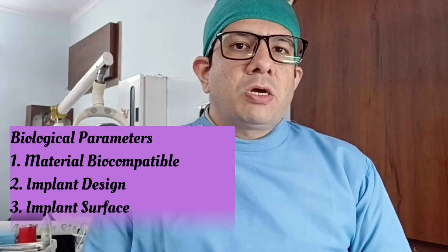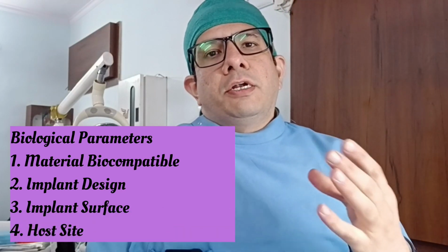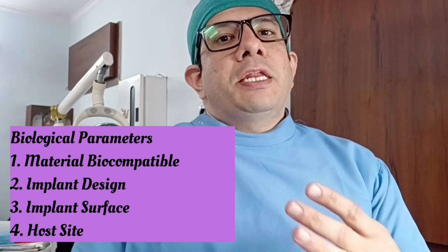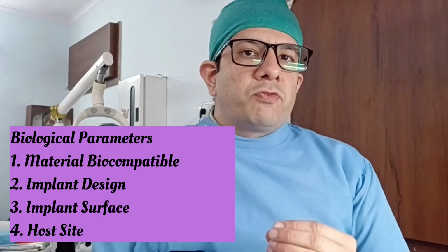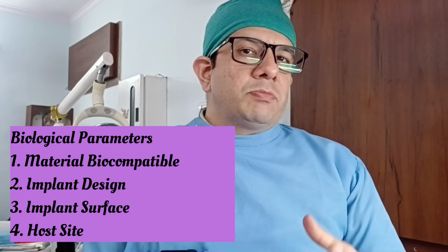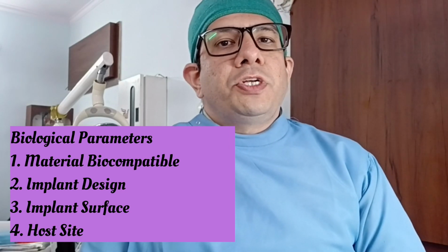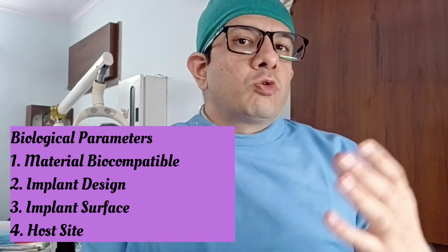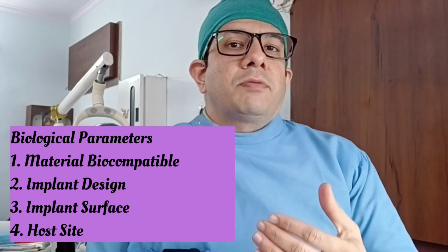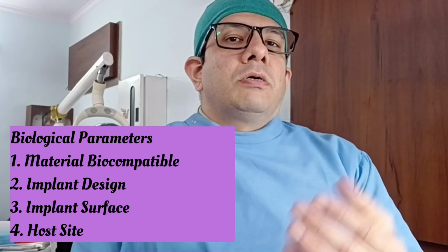First is material biocompatibility, in which titanium is the most frequently used dental implant material. Then implant design, cylinder form is the most commonly used. Then implant surface, it is either plasma sprayed or surface etched to increase its osseointegration property. Then host site, the site where either maxilla or mandible which is receiving the implant.